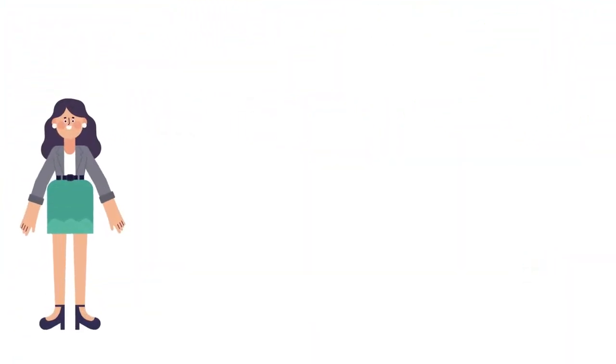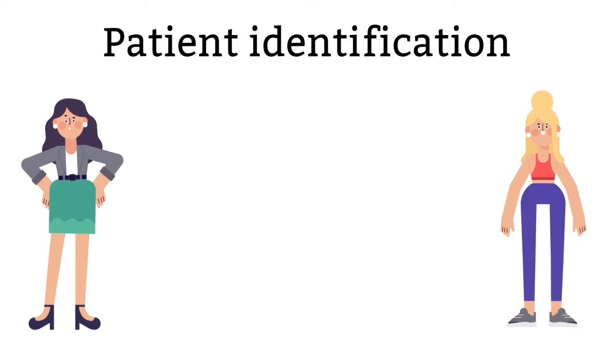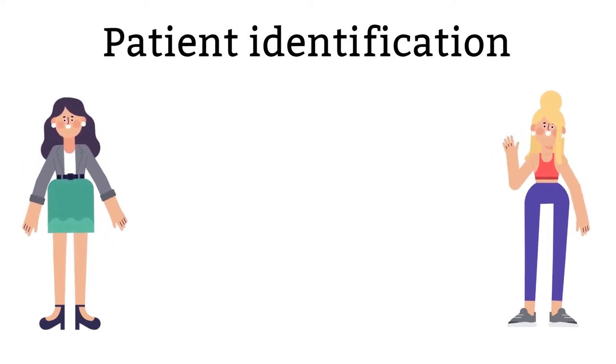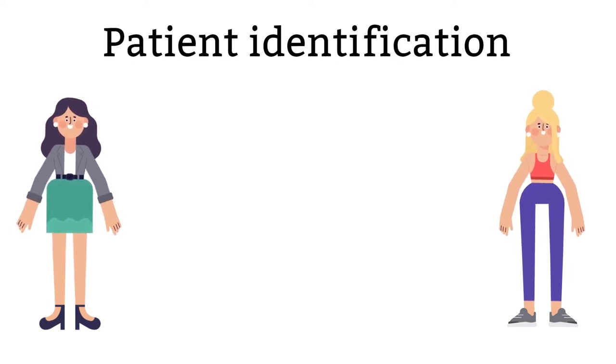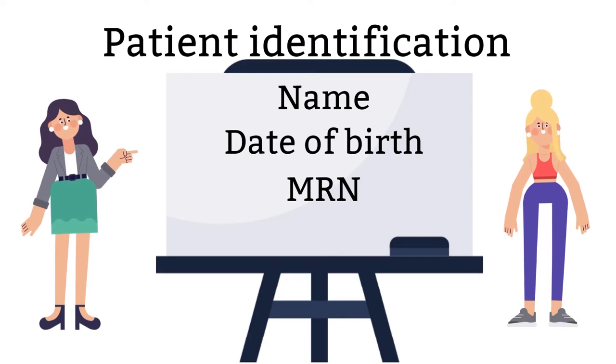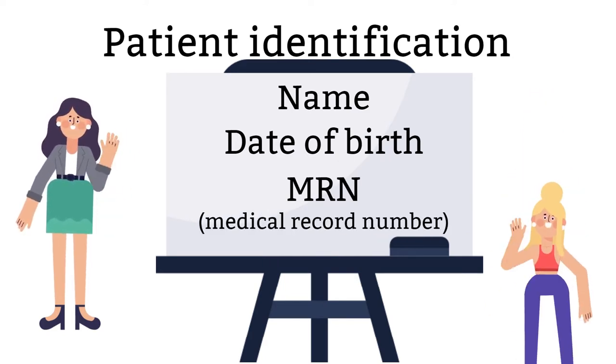After you have identified yourself, you will have to identify the patient. Correct patient's identification is the key to patient care. Wrong identifications can lead to wrong diagnosis and treatment. Ask the patients for their full names and date of birth or medical record number. Do not forget to check the patient armband if you are drawing an inpatient.